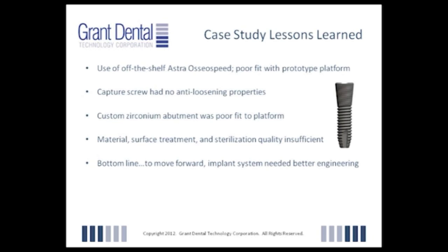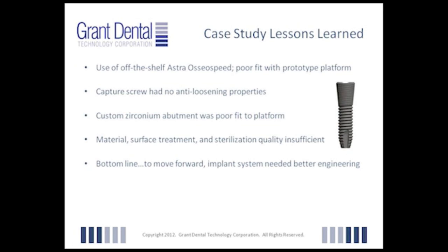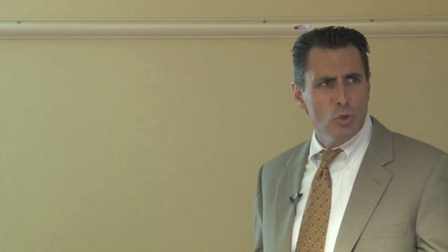We had talked about it. You know, we used the OsseoSpeed. It had that poor fit because you can see that it has threads all the way to the top, which actually makes a micro gap all the way to the top. The capture screw, we used their typical capture screw, and I think you had one come loose or something. Two came loose, the screw loosened. Yeah, so it loosened, and we know that that contributed. Obviously, if the screw's loose, then you don't have good contact. The zirconium abutments, we had them made to that platform that we had machined, and we felt like that it wasn't a perfect seal.